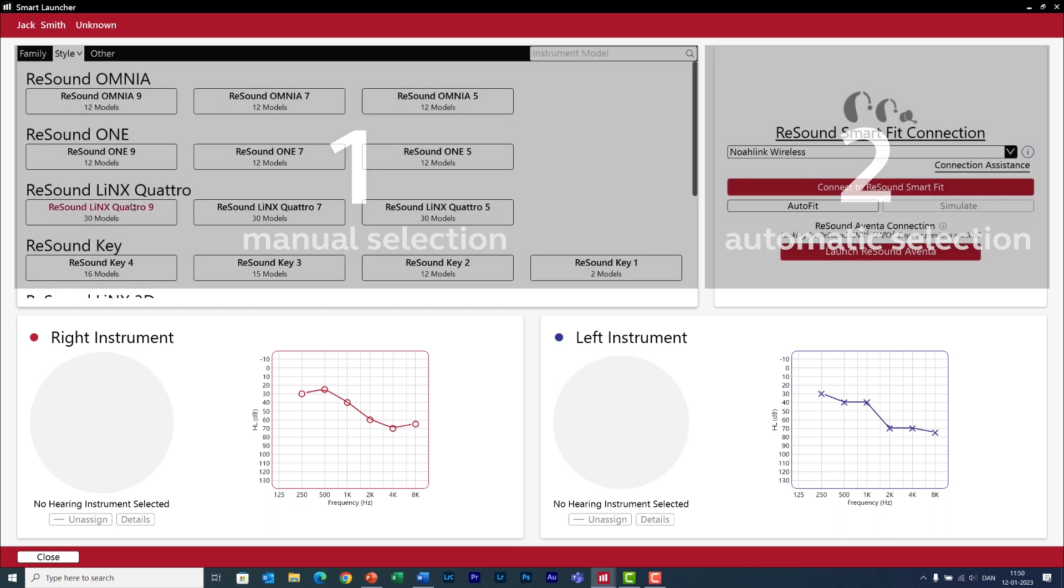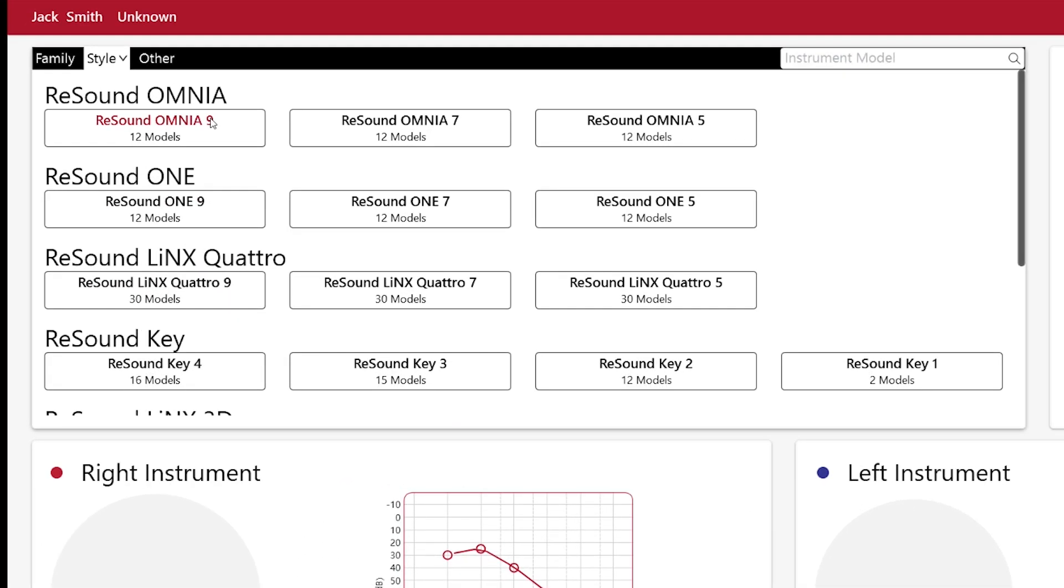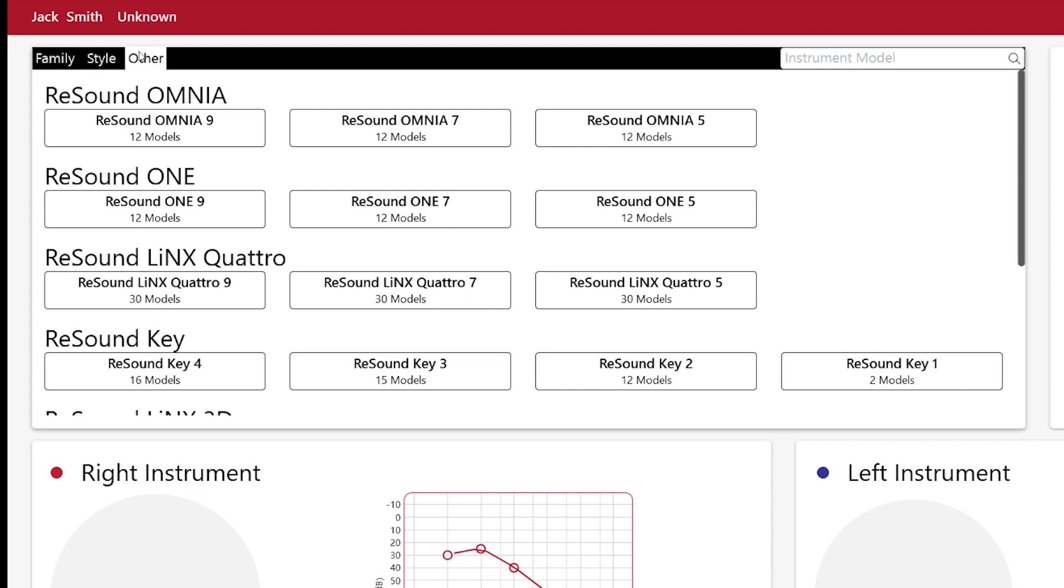Here you can see the current ReSound portfolio and it is arranged according to price points. If you are new to ReSound, here you have search and filter options that can help you to find the hearing aid you are looking for.